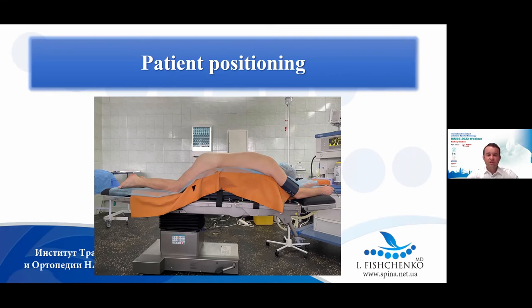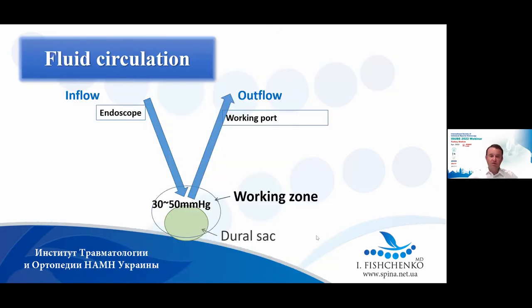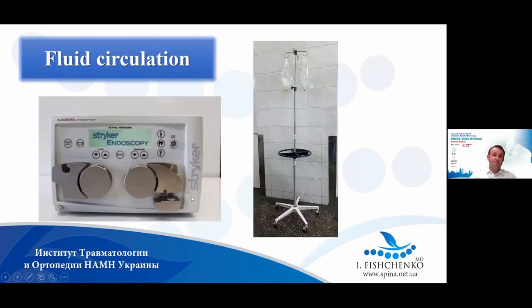For fluid circulation, it's very necessary to control the water pressure, about 30 to 50 millimeters, because if it is less there will be more bleeding, and if it is higher it could cause different complications. For fluid circulation, it's possible to use an arthroscopic water pump, or just a tripod using natural gravity. I prefer to use a tripod. You can control the pressure of water by putting these saline packages higher or lower.